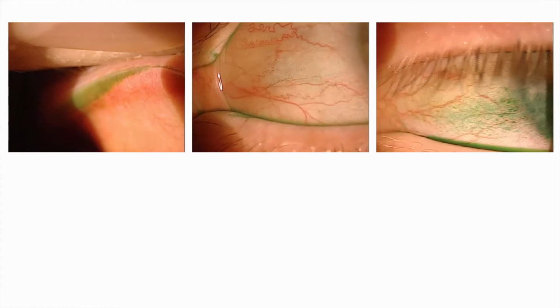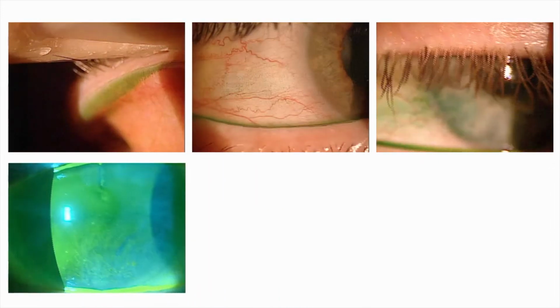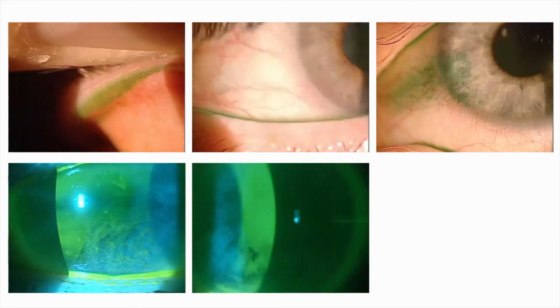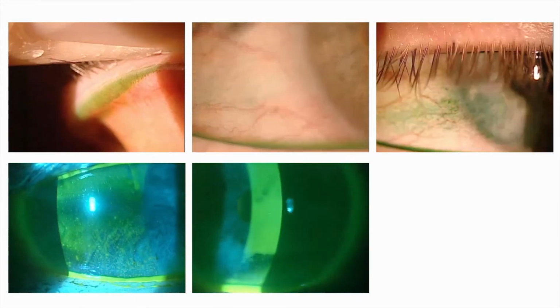Viewing conjunctival and corneal staining with lissamine green is also a sign of ocular surface compromise. If present, fluorescein also allows us to see punctate epitheliopathy. Additionally, because of the hydrophilic nature of the molecule, it allows for the visualization of the tear film.